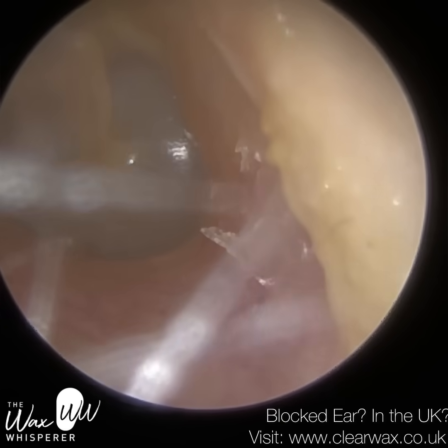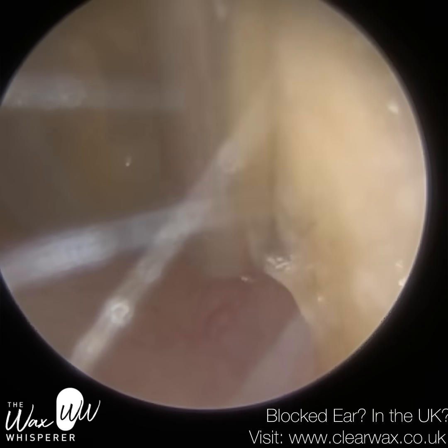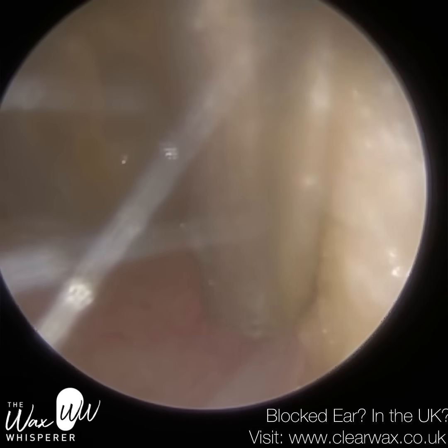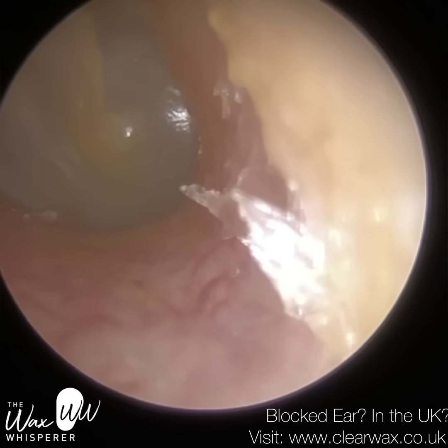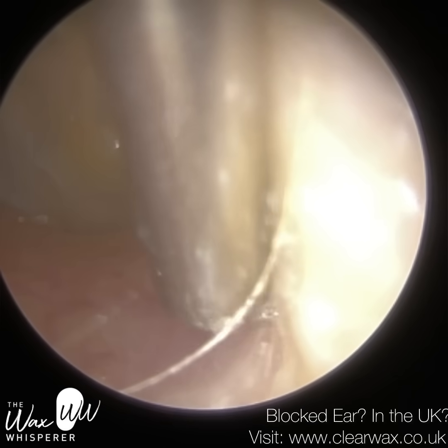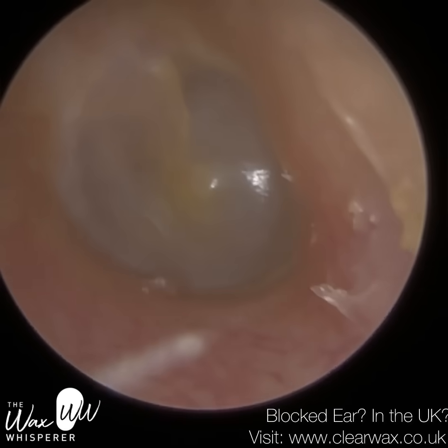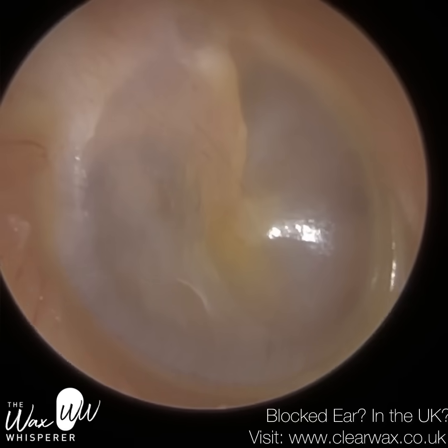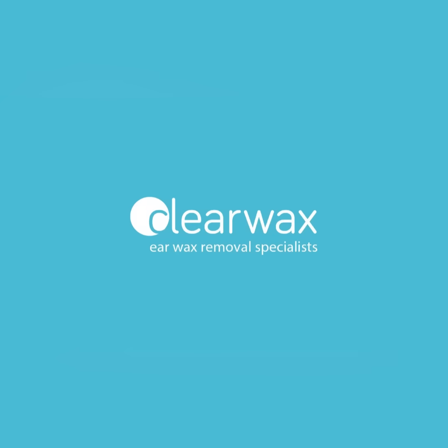Going back to the original point, as we age, we get atrophy of these glands. So basically they get smaller, they're less functional, which makes the skin much drier because it's less lubricated, and then the skin, because it's dry, is not able to migrate as well. So this skin that I'm peeling away, under normal circumstances, it probably would have desquamated, so it's shed off the canal surface, but it hasn't. So I've just gone in, peeled it all away. The patient could hear okay anyway, but they felt 100 times better.